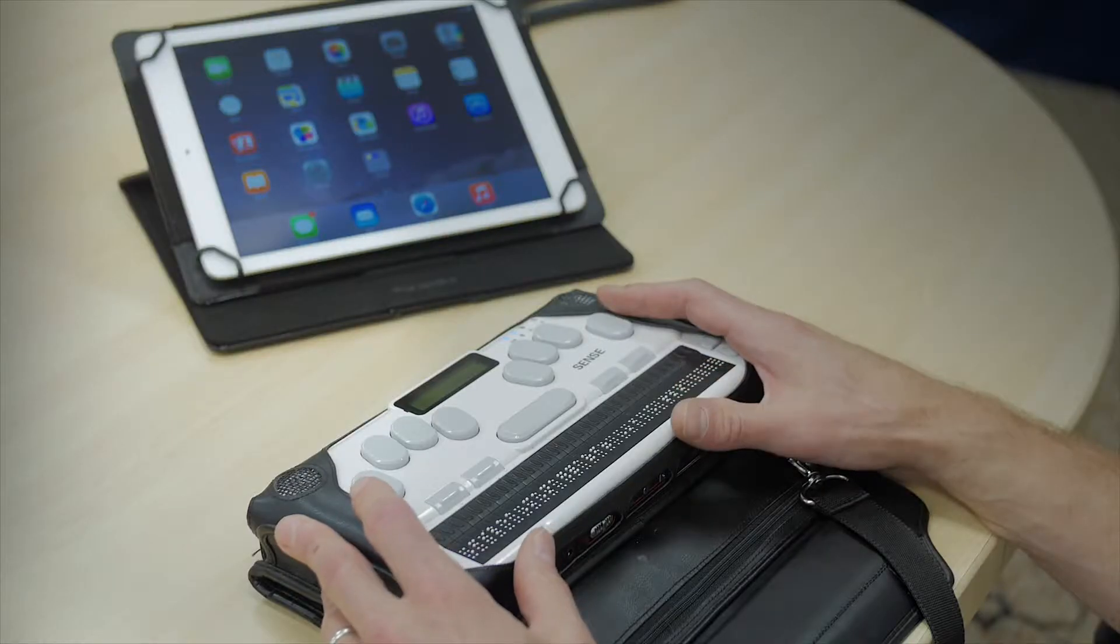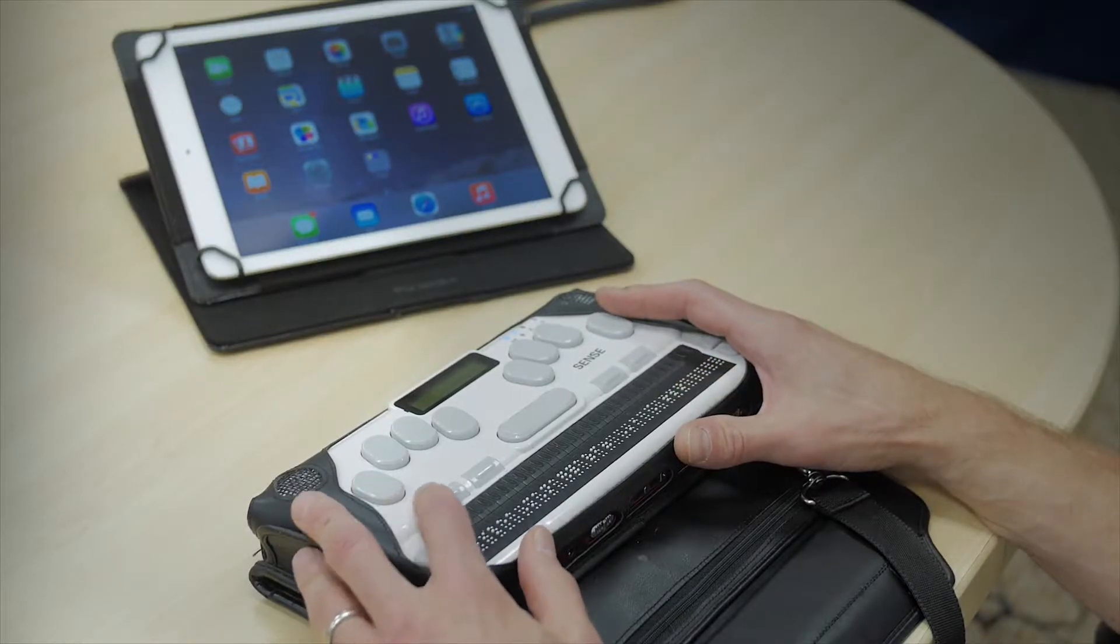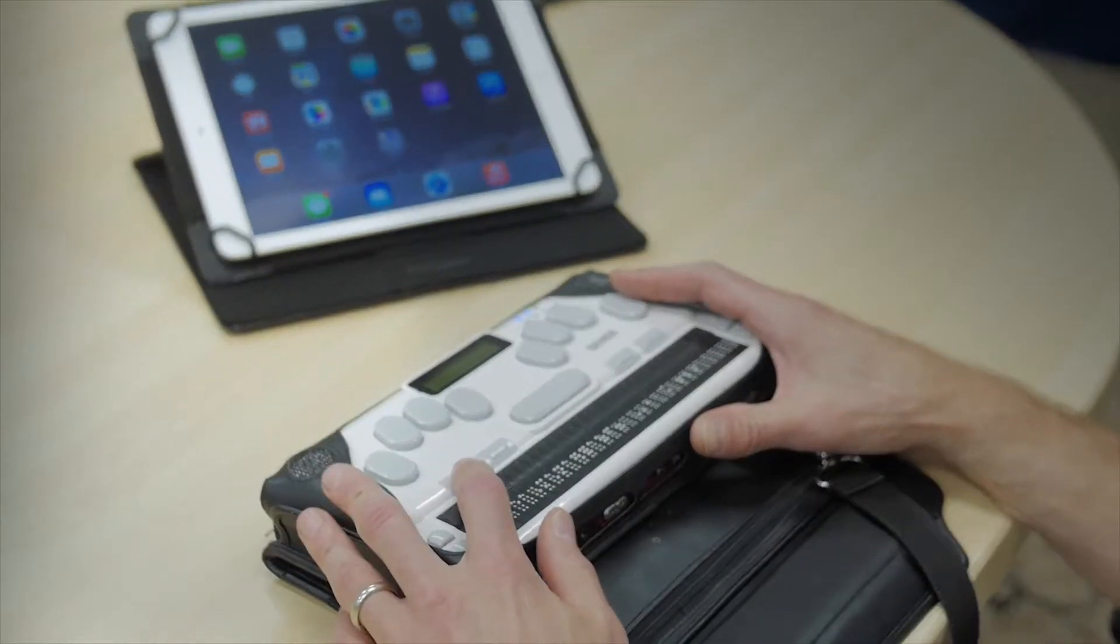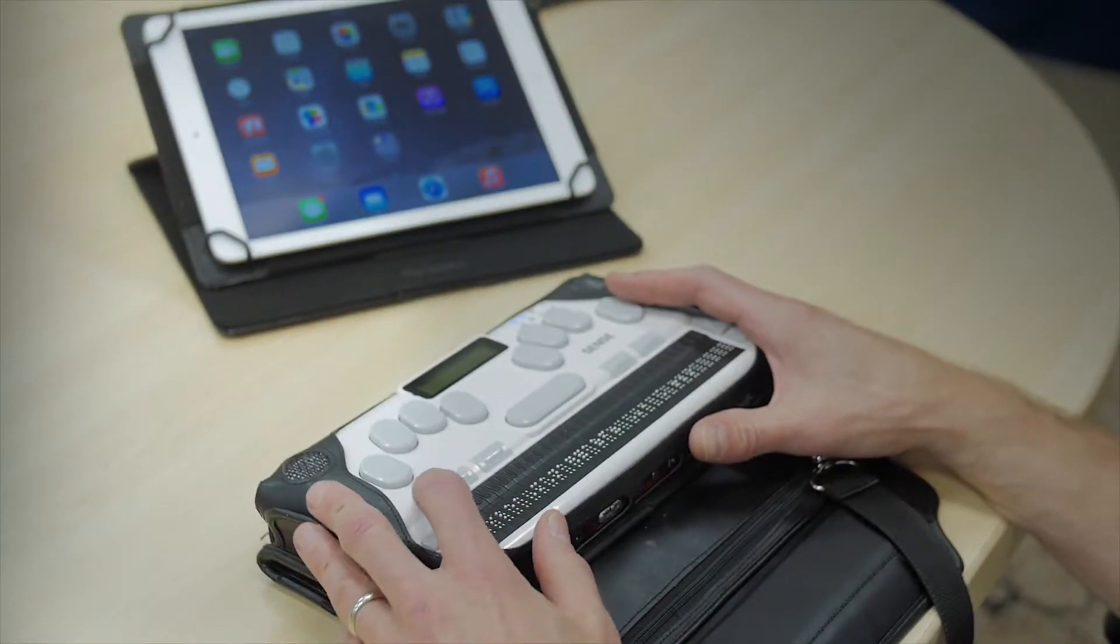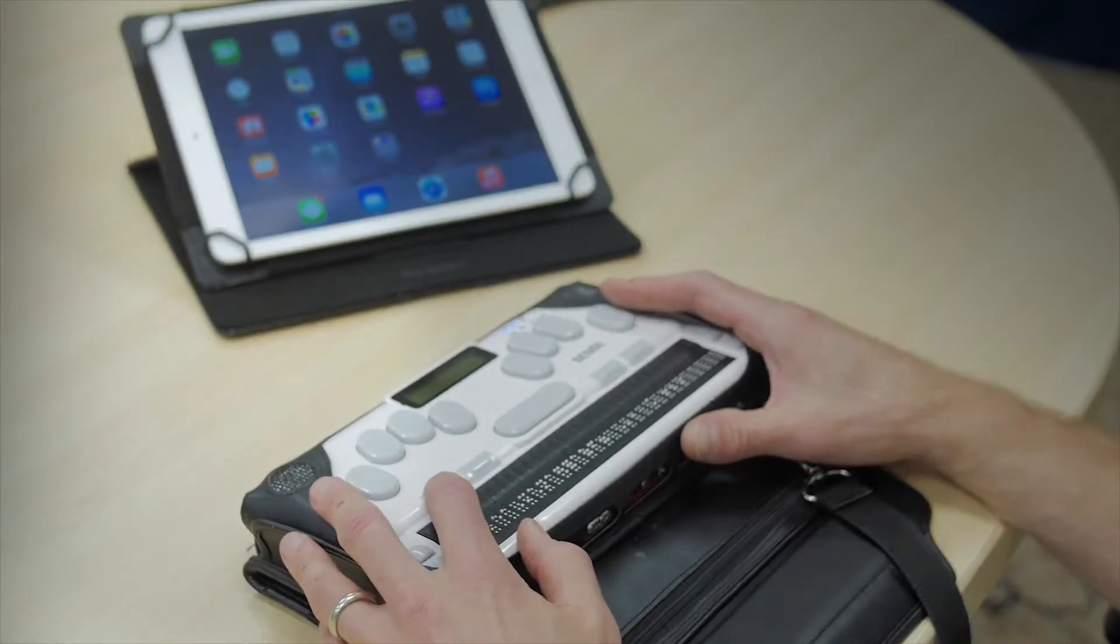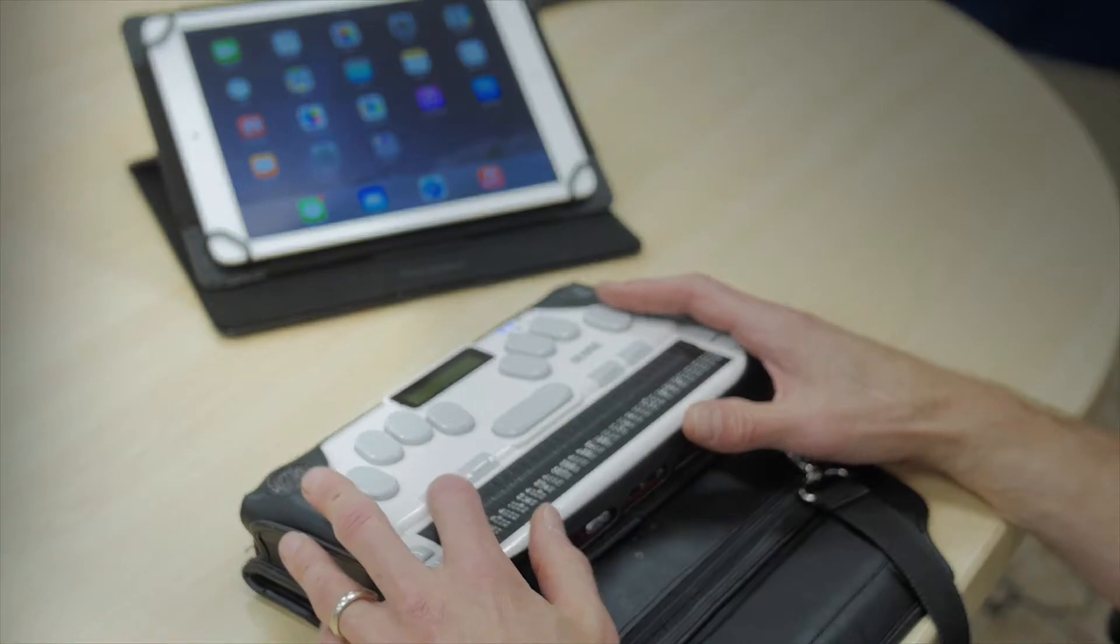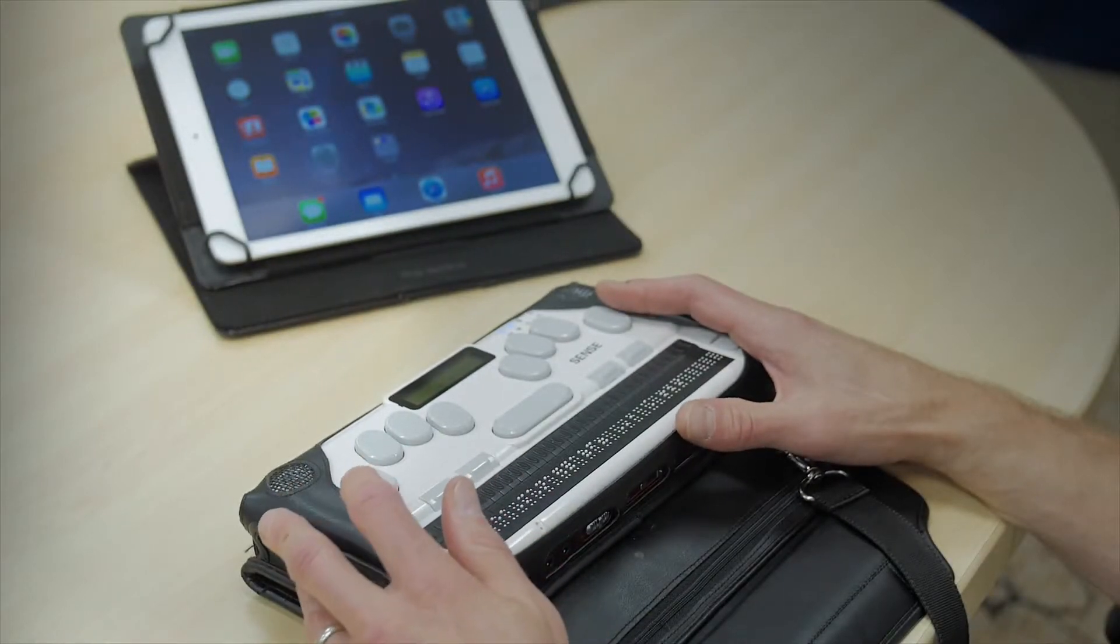The first thing that we're going to do so that we're all in the same place is I'm going to press function key 1 on the BrailleSense which will take me to the BrailleSense start menu and say that I'm at the file manager.